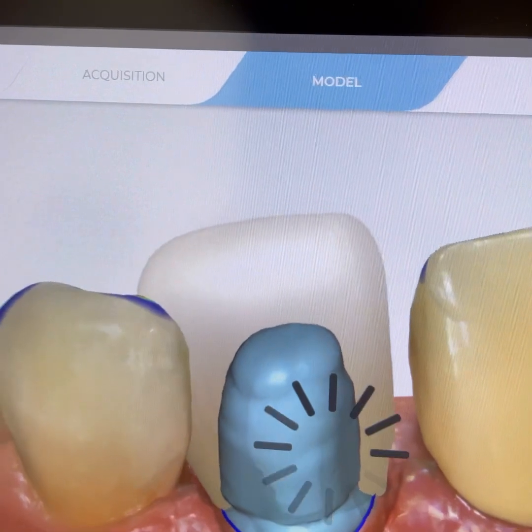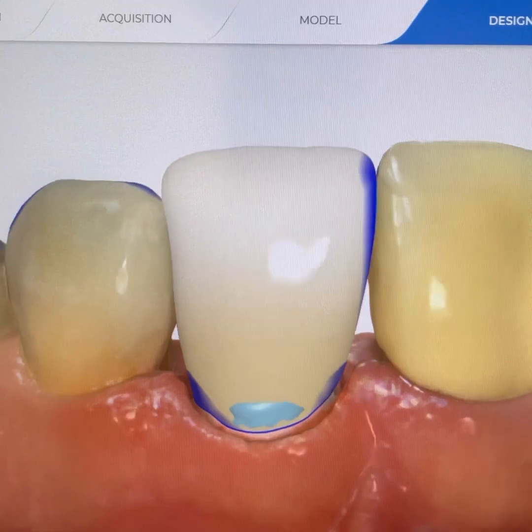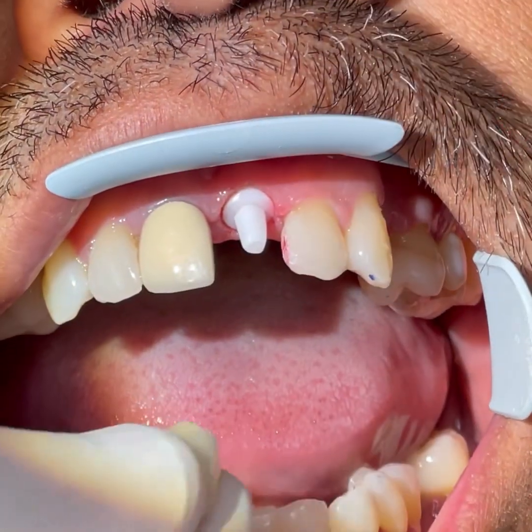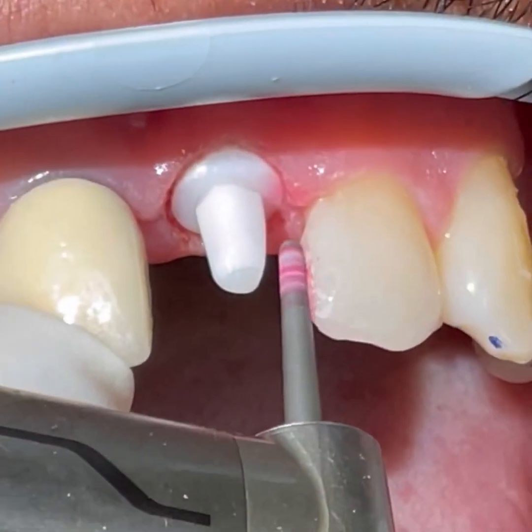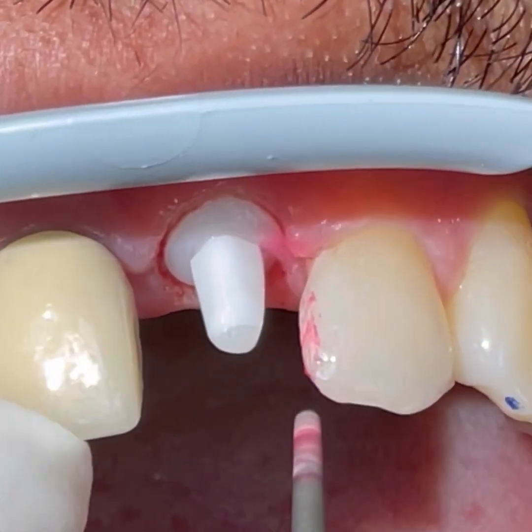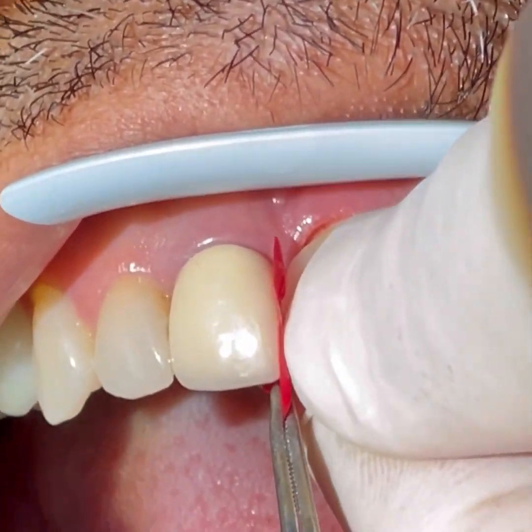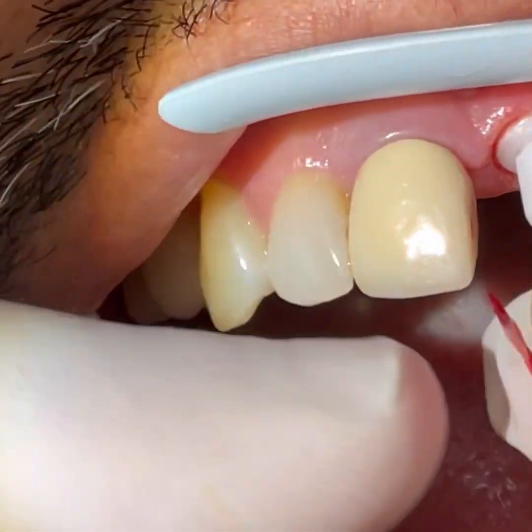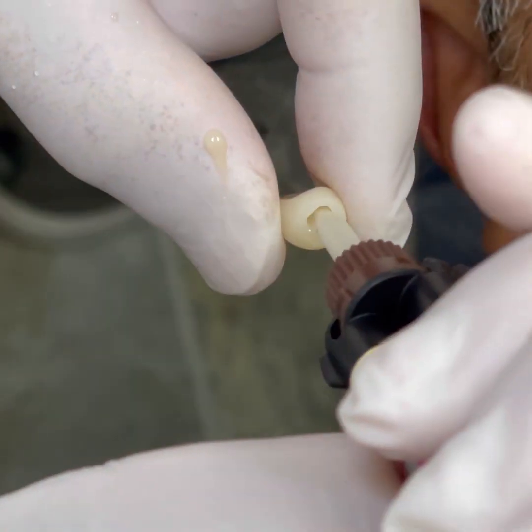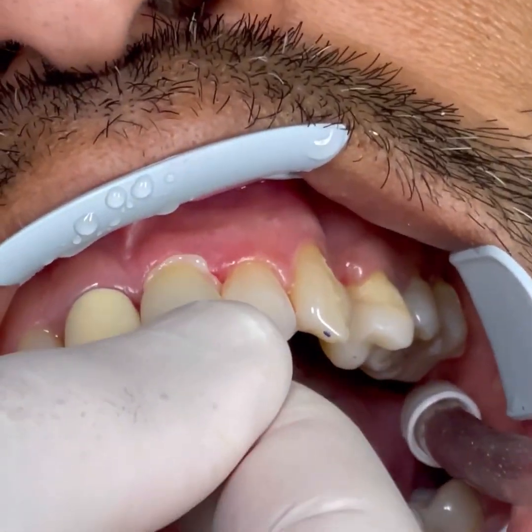I will not showcase the details of the CEREC fabrication. However, we have to remember that implants are completely rigid and have no give — therefore if the proximal contacts are not adjusted properly, the crown will not fit all the way and will create problems. This is my favorite way of adjusting proximal contacts. In my case, on both sides there was a bulging filling and an older crown that will eventually be replaced, so I was adjusting those adjacent contacts.